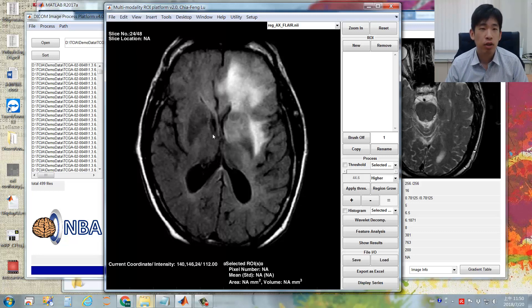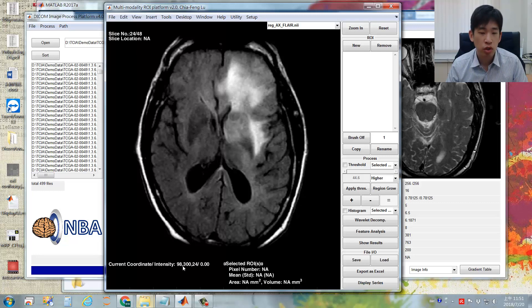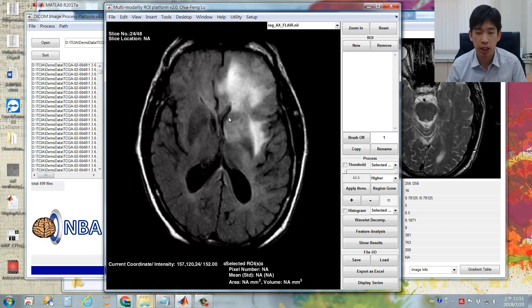You can see there is some information displayed in this imaging panel. There is the slice number — the displayed image is the 24th of all 48 images in this image contrast. There is also an indicator showing the current mouse coordinates and the image intensity, and the numbers are kept updated as you move your mouse.